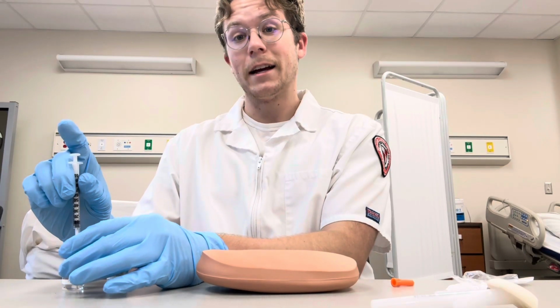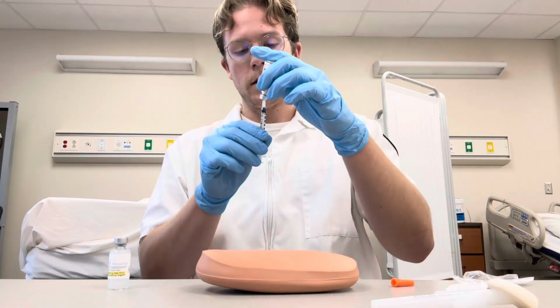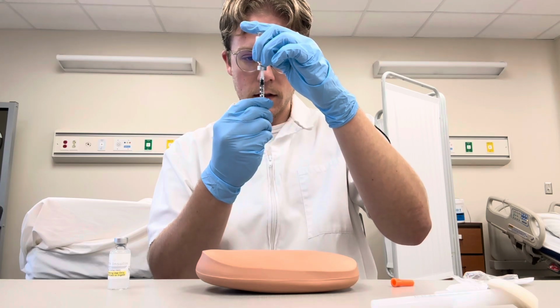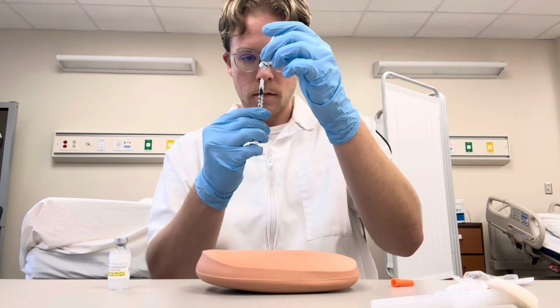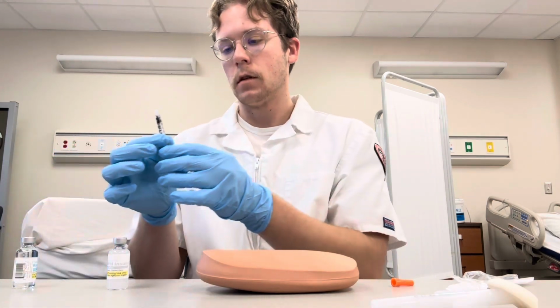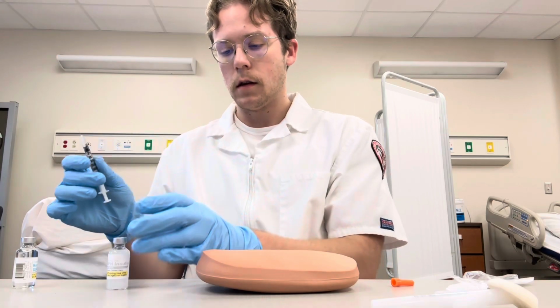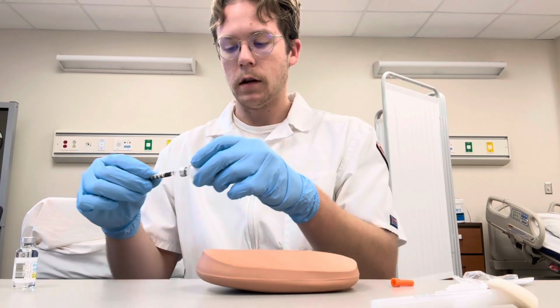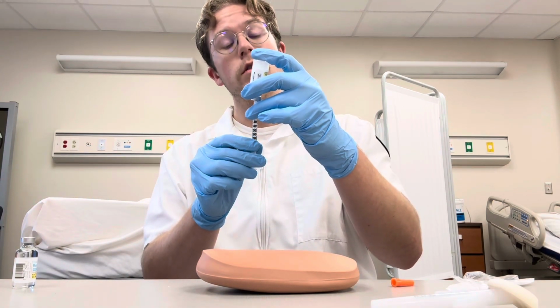And we would actually leave the syringe in for the regular. And then we would turn it upside down and draw back 6 units of our regular clear, trying to get any air bubbles out. And then 16 of our cloudy. So that will be 22 total.